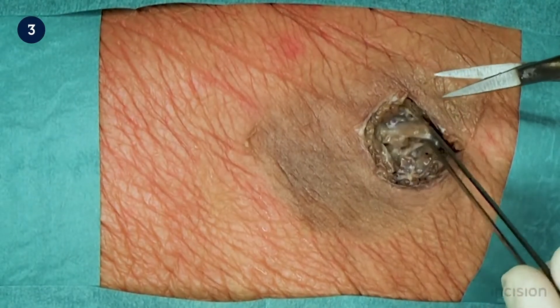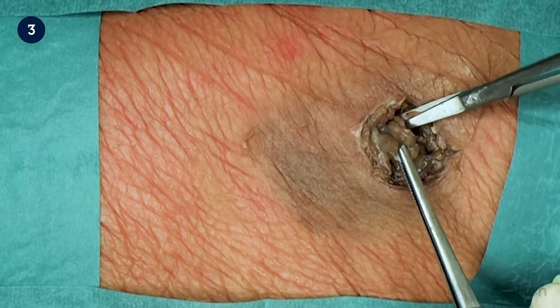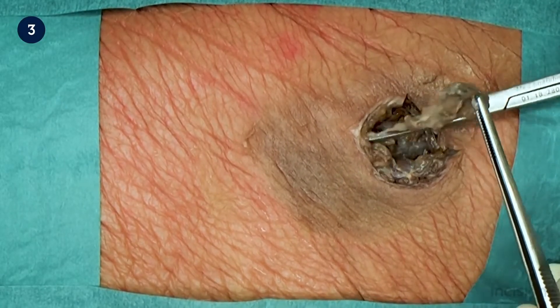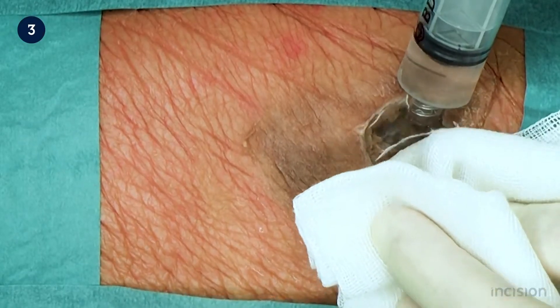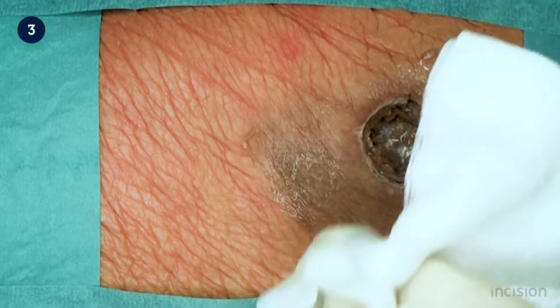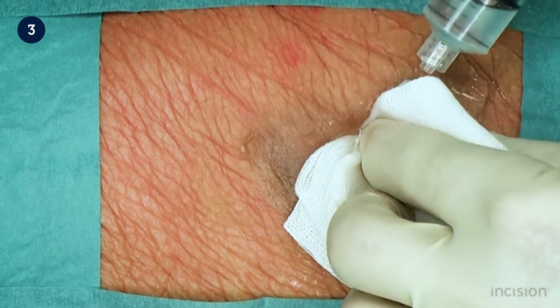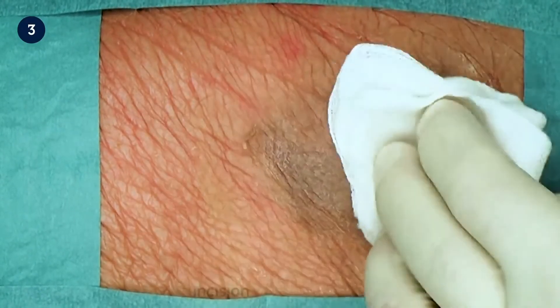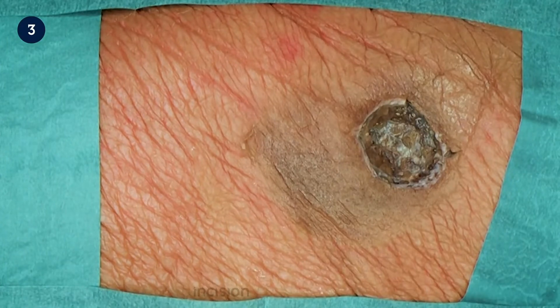Additional sloughy or pyogenic tissue within or forming the abscess cavity can also be removed. The wound is again irrigated using normal saline solution to ensure that all debris and visible pus is removed. An absorbent wetted gauze dressing should then be applied to cover the wound, which should be checked and the dressing changed at regular intervals.